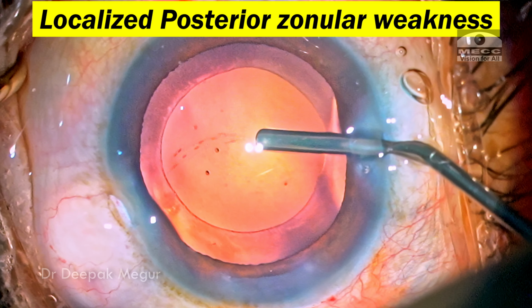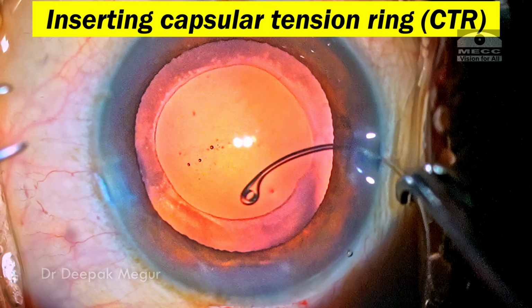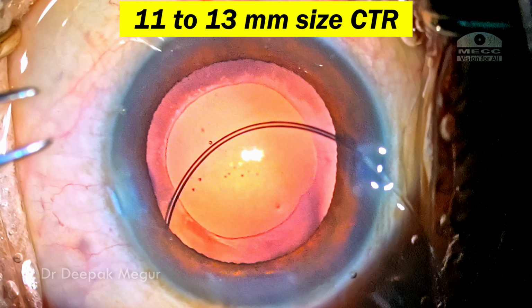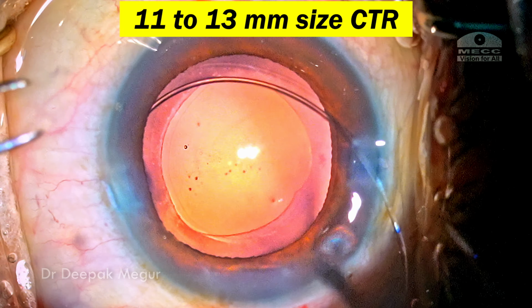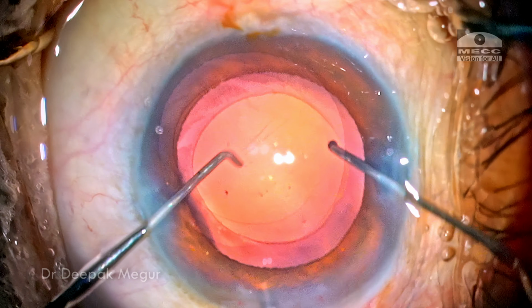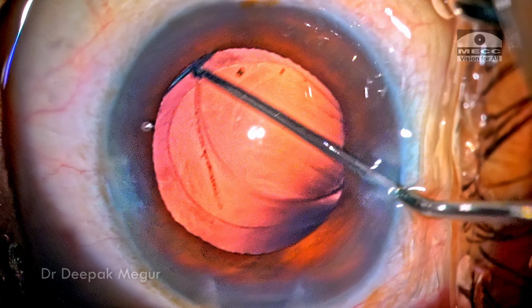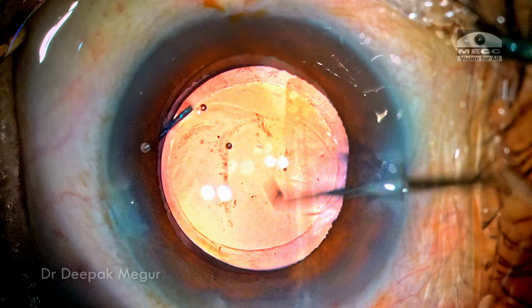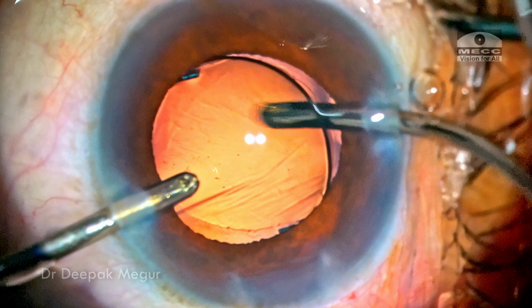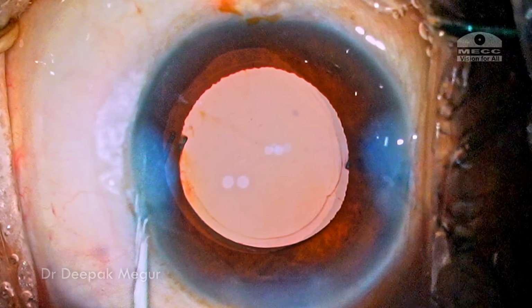And now I'm sure that this is a case of a localized posterior zonular weakness, and I would want to support it by using a capsule tension ring. So I'm going to use a capsule tension ring which is 11 to 13 mm in size, and it is being threaded into the capsular bag. The originally planned multi-piece hydrophobic lens is being implanted into the eye. OVD both in front and behind the lens is aspirated out, and the side ports are hydrated.